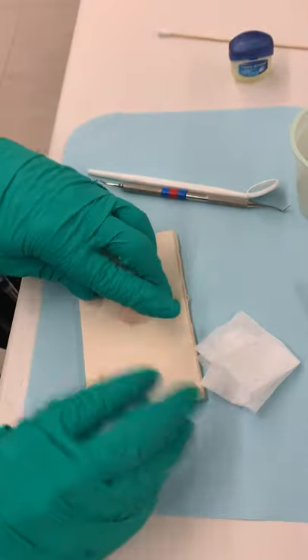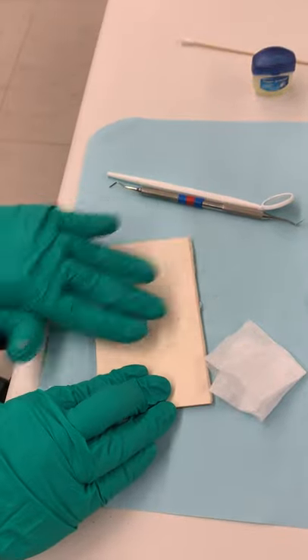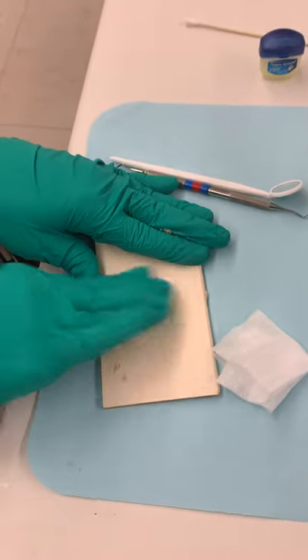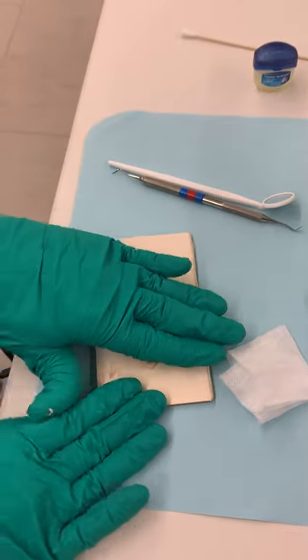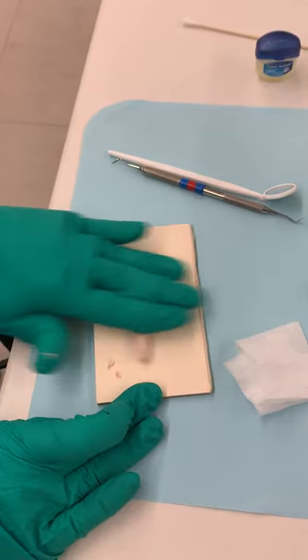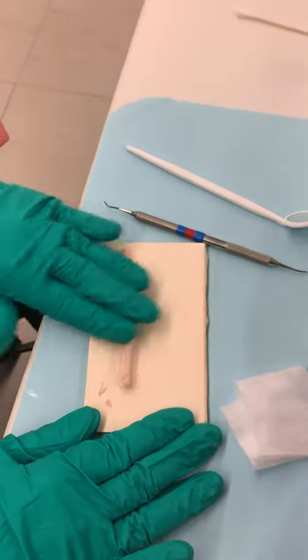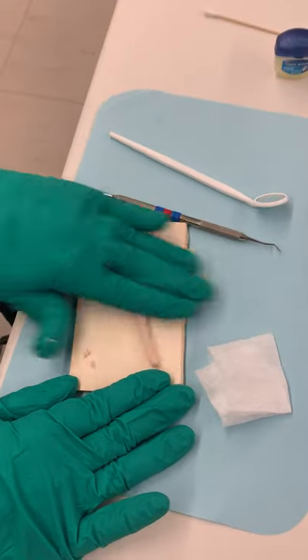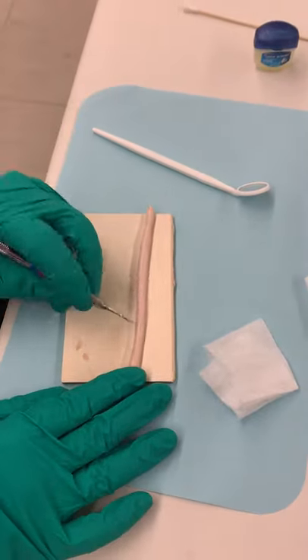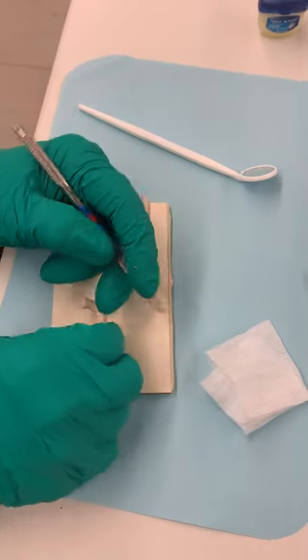It's very sticky — kind of like silly putty now — so we're going to roll it out into a little worm. Since I have a small surgery site, I have quite a bit of material here and don't need that much, so I'm going to cut two little worms off of this.